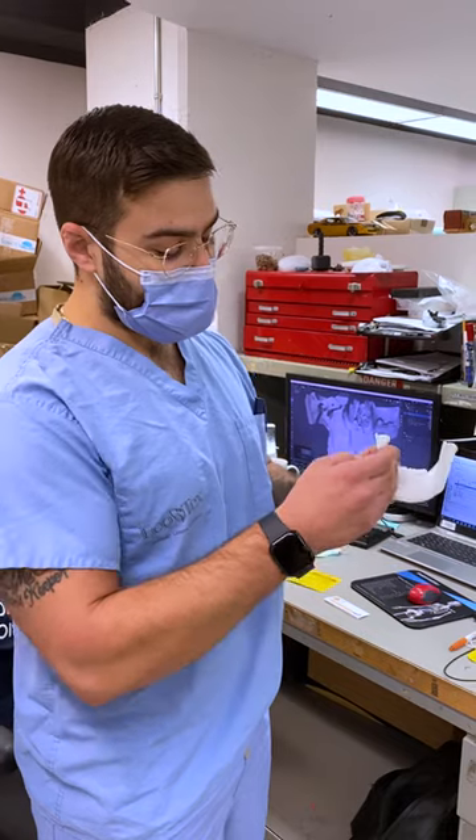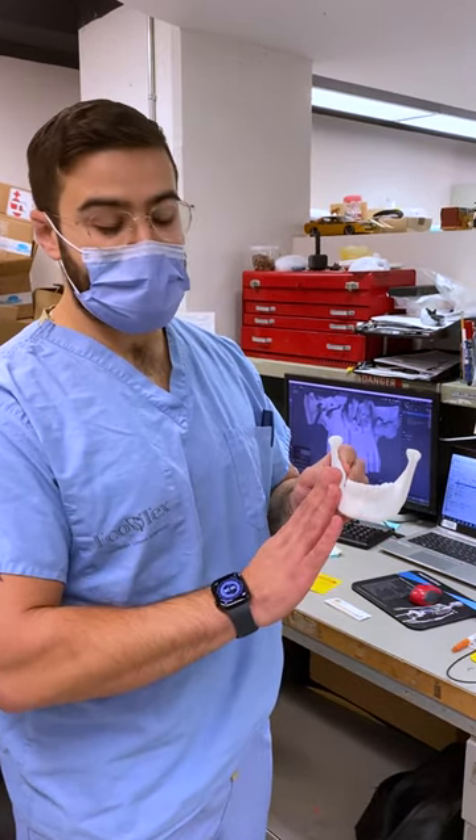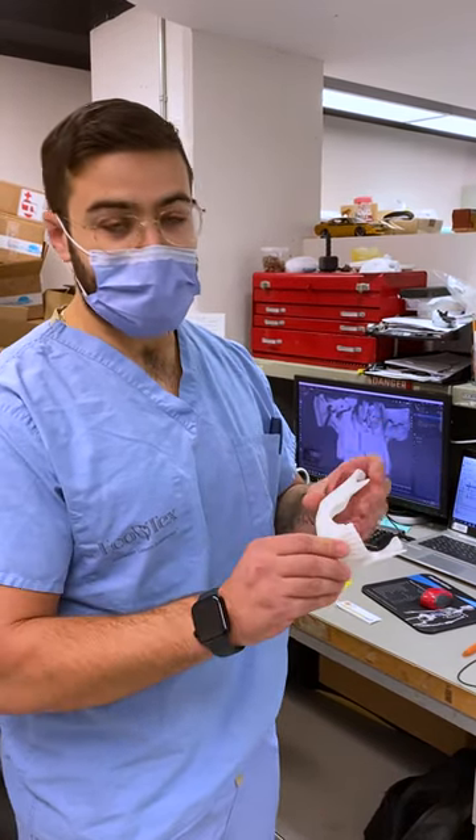What we can also do with this model is cut it in half and mirror the good side of the jaw to the bad side, allowing the surgeon to pre-contour plates before surgery. This saves them roughly 15 to 20 minutes during surgery.